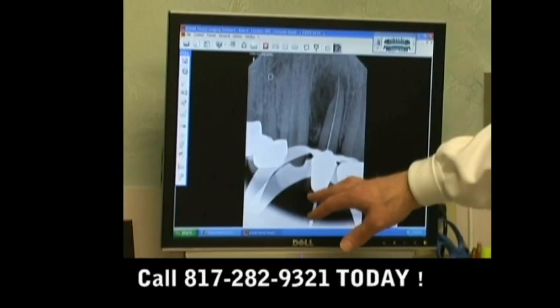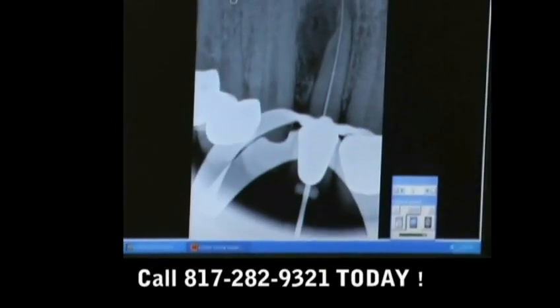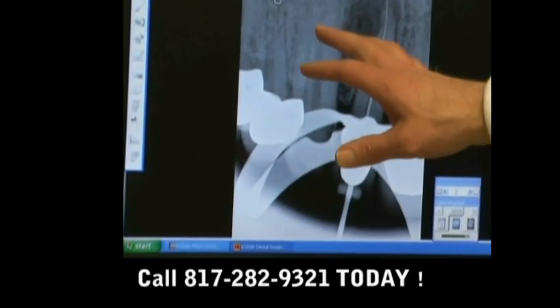Here's what we're looking for on the length. Normally I can do that without taking an x-ray, but when you've had a crown done, sometimes we have to use the x-ray.